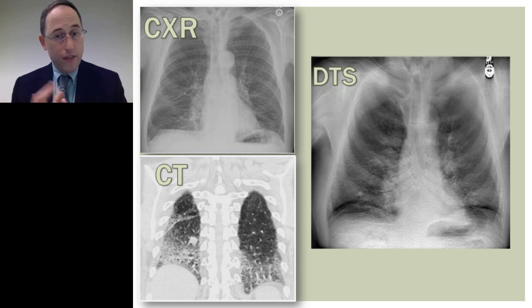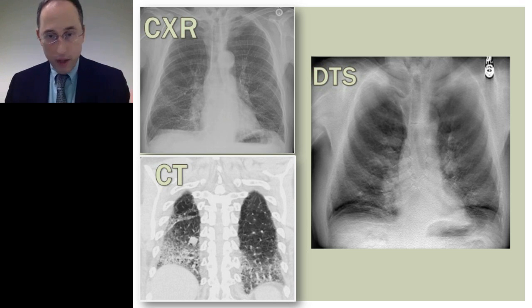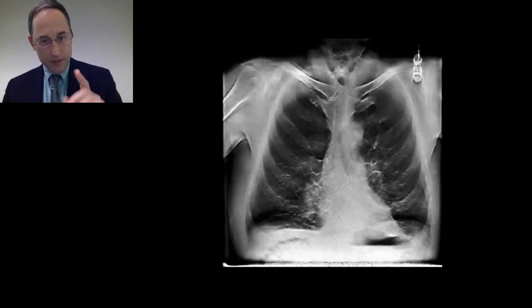I'm going to show you now a video scrolling through that tomosynthesis image stack to give you a sense of what these things will look like. Oh wait, I'm sorry. We'll come back to that. Okay. Oh yes, I'm sorry. Here it is. So here we go.